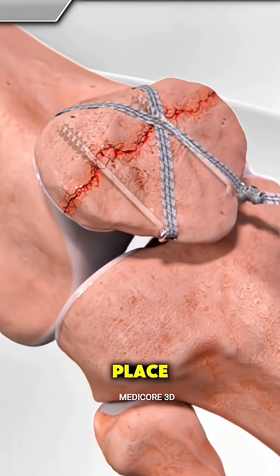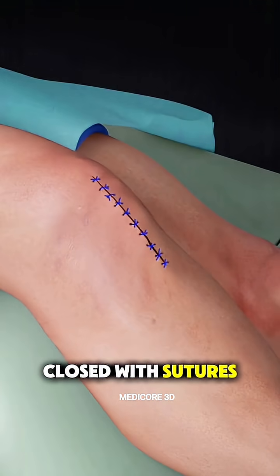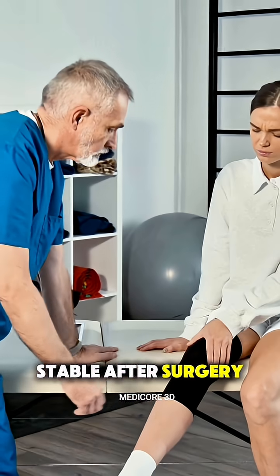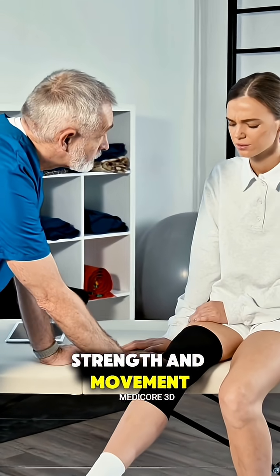Once everything's in place, the incision is closed with sutures or staples, and your knee is typically placed in a brace or cast to keep it stable. After surgery, physical therapy is key to regaining strength and movement.